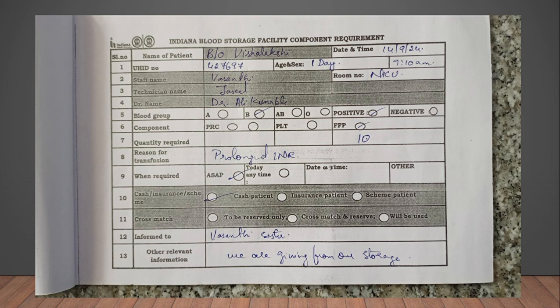So you must always enter the reason for transfusion, and then ask when they require it. Is it an emergency, where they want it immediately, or is it today, if they can get it, it's well and good. Sometimes it is required for the next day's surgery or scheduled operative procedures. At that time they will tell exactly when the surgery is and at what time it is required.